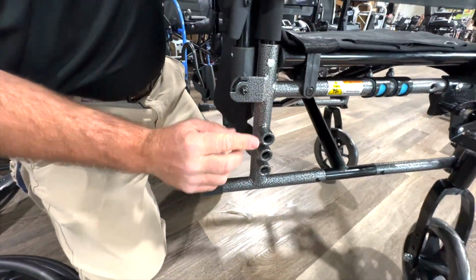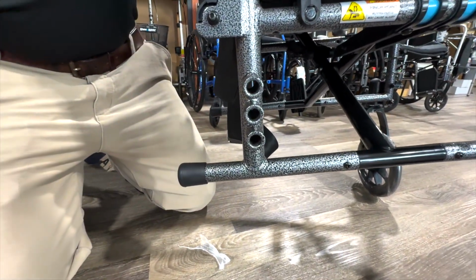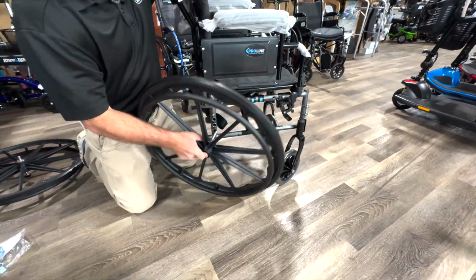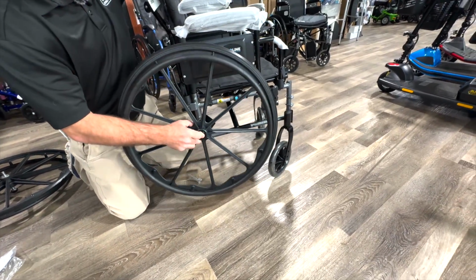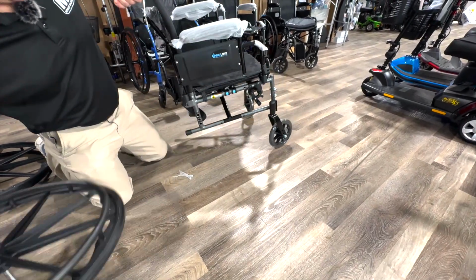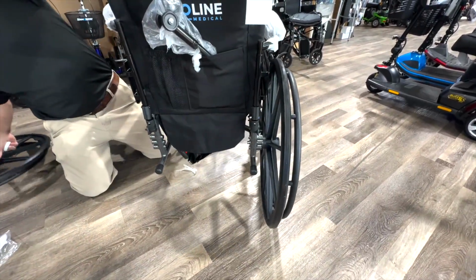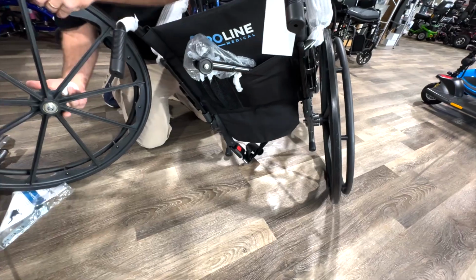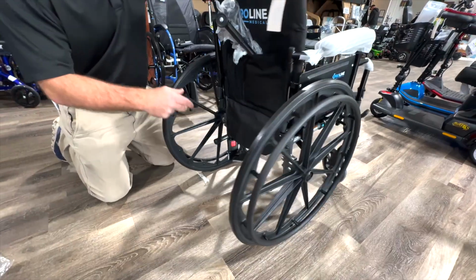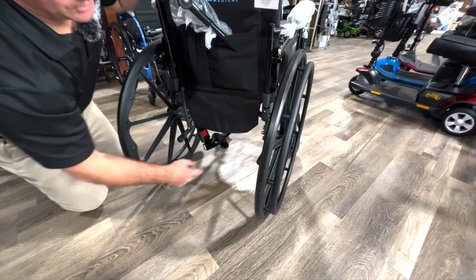Different height adjustments. You have seat. That's height adjustment. So let's say you're taller. You'd come put it right here at the bottom, or you're shorter. So if you want to reduce the seat height because your legs need to get on the ground, you can do that by putting it here to make the seat higher, or here to make the seat lower.